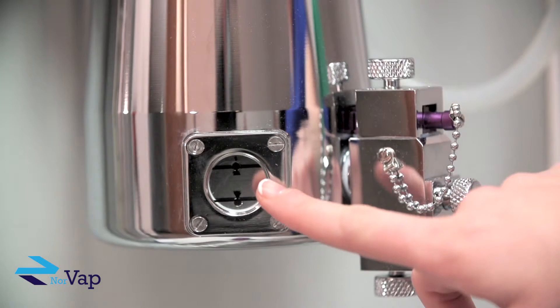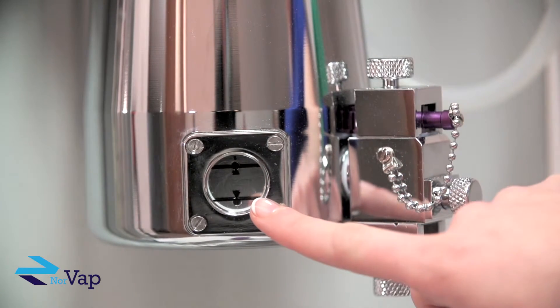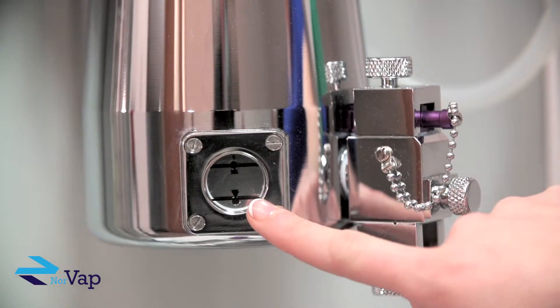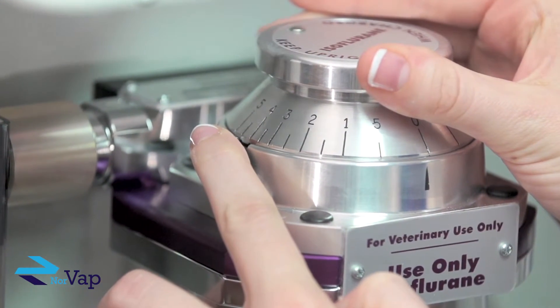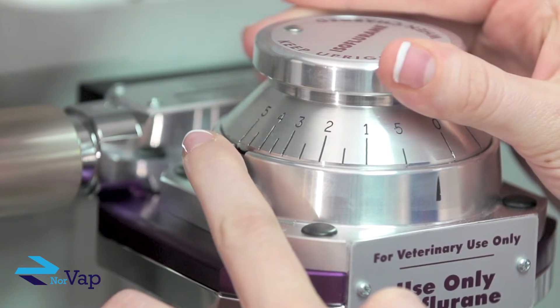The window here indicates the level of liquid anaesthetic agent. The dial allows the user to control the output of anaesthetic drug by rotating it counter clockwise to the desired percentage of drug.